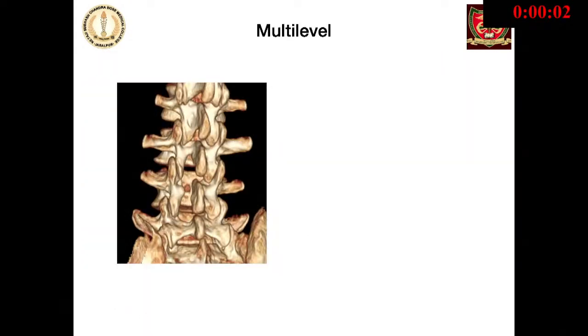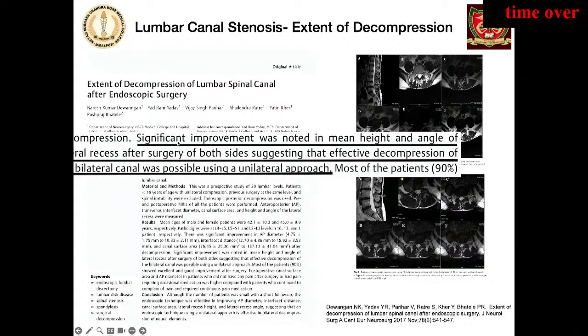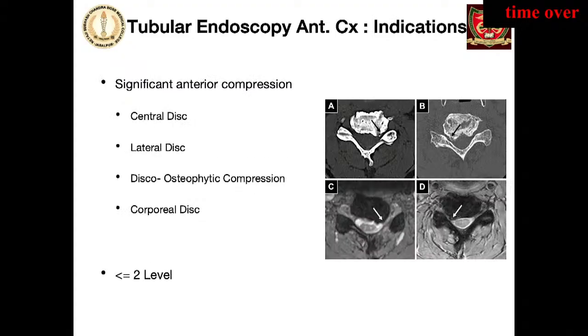This is another case. You can see the complete decompressed thecal sac. This is the bony work which is done. This is the multi-level, 2-level you can see. We have published the paper also.